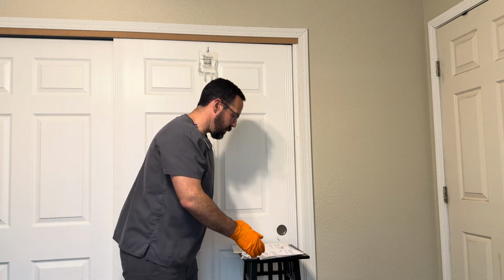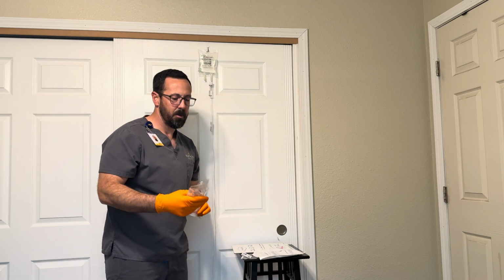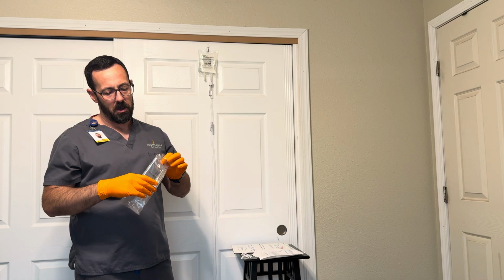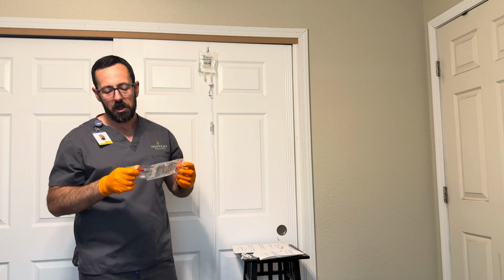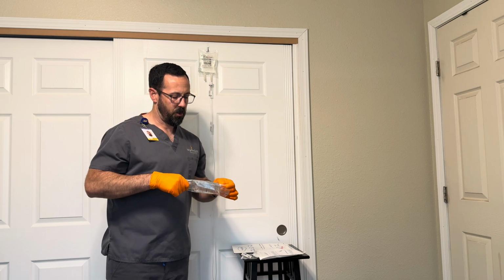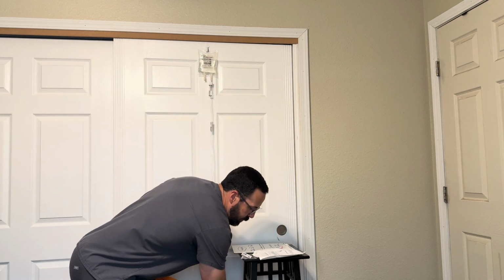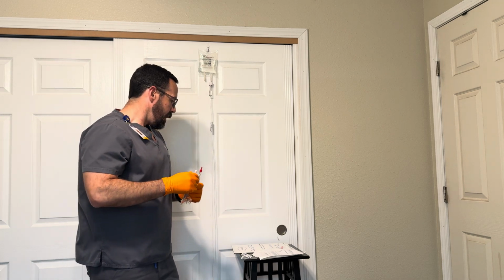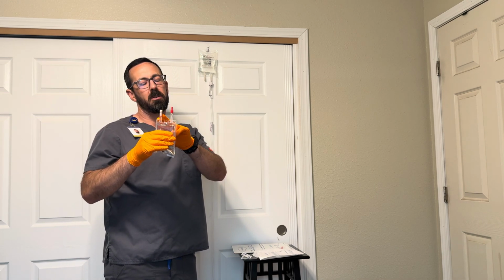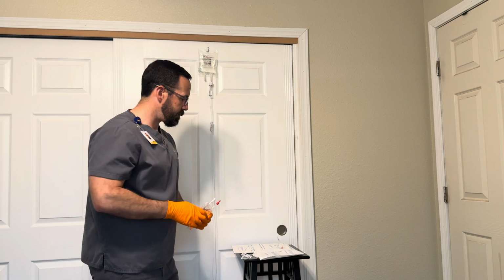So now we need to do the medication. So again, verified the correct patient through 2 patient identifiers, we went through the 6 rights of administration. We verified the patient does not have any allergies. And again, going to check this against the MAR before administering, which we've done as well for a second and third time now. And I have my piggyback, same setup. It has an injection port for any additional medication, as well as my spike port.